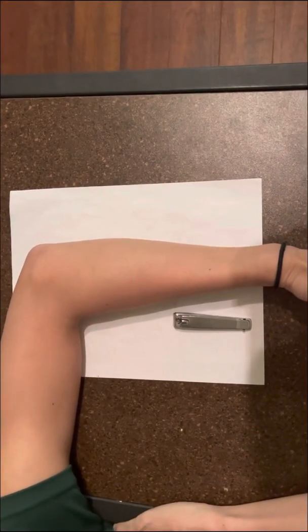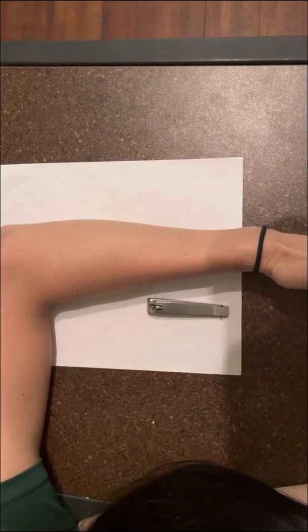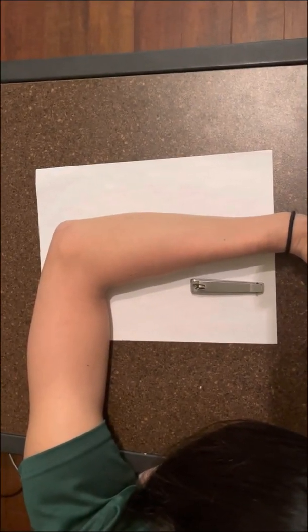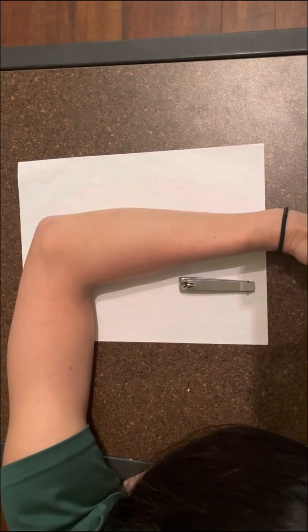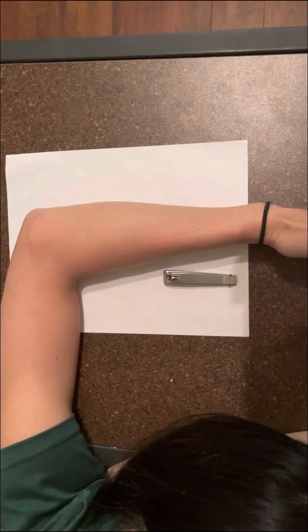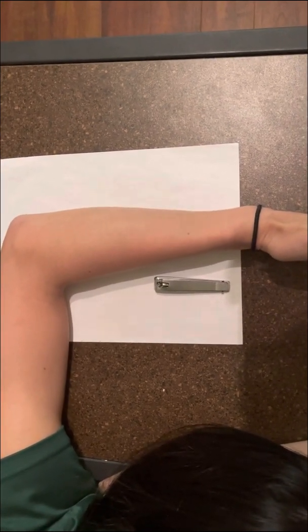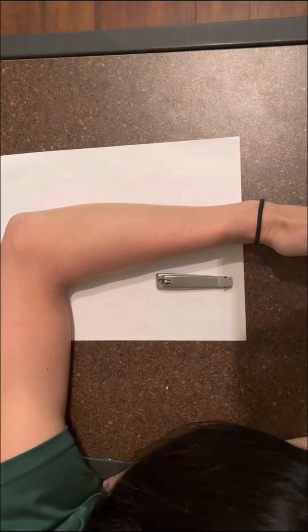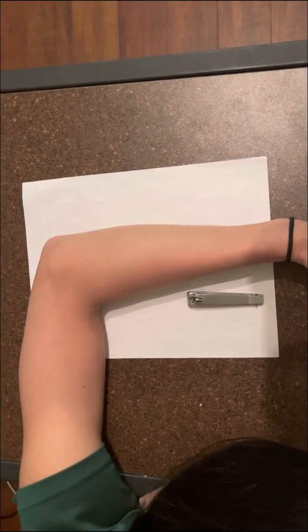For the lateral forearm, the patient's shoulder and the humerus are parallel to the table with the forearm. The elbow is flexed 90 degrees, and the hand, wrist, and forearm are rotated to lie in a true lateral position resting on the ulnar surface. A line through the humeral epicondyles is perpendicular to the film plane. The central ray is perpendicular to the midpoint of the film space. Anatomy demonstrated is a lateral projection of the radius, ulna, distal humerus, and proximal row of carpal bones.